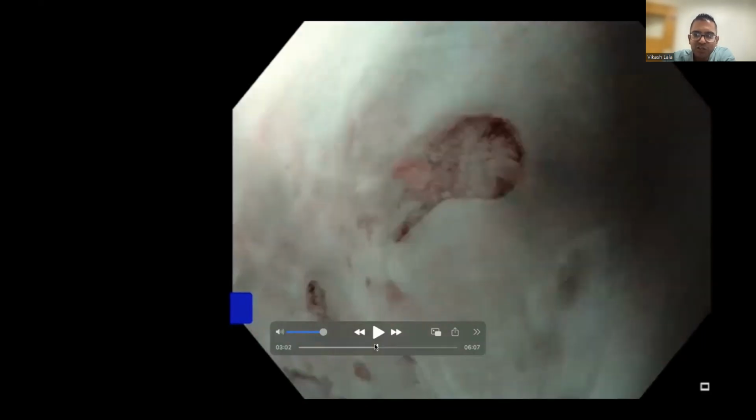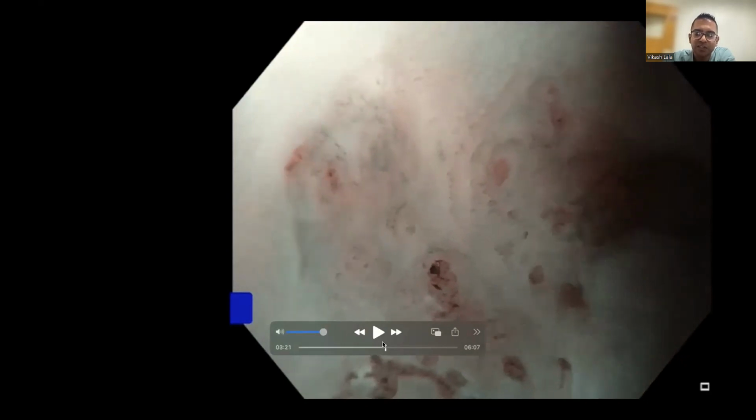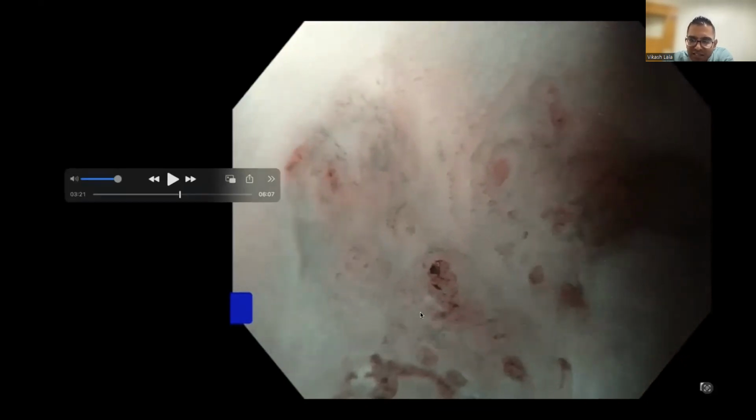But again, within that nodular area, so I sat on the nodular area with my cap, I put it under water, I'm using near focus. This was an HQ190 scope, so I had near focus. And you can see that there's several areas. And again, that looks irregular, but some structure. And several areas where there's just an irregular mucosal and vascular pattern, but difficult to appreciate because it's overlain by squamous epithelium.